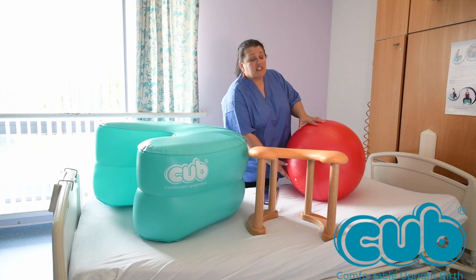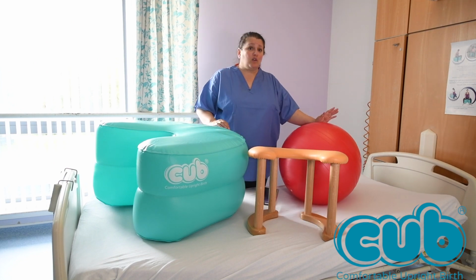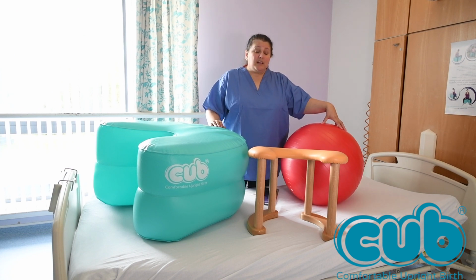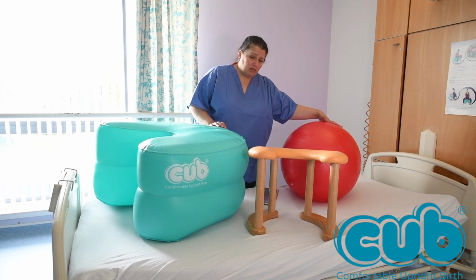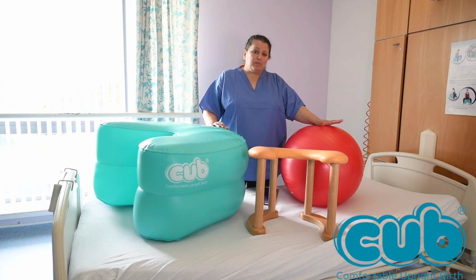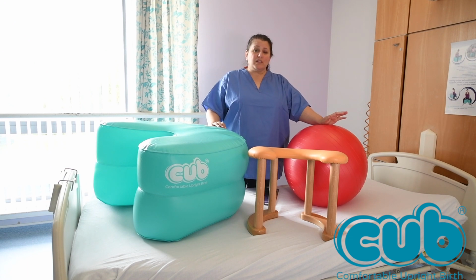So, firstly, there is no such thing as a birth ball. They are all designed as exercise balls. Nobody can actually give birth sitting on a ball either. It doesn't really work very well. They're a fantastic product to promote upright positions in early labour.